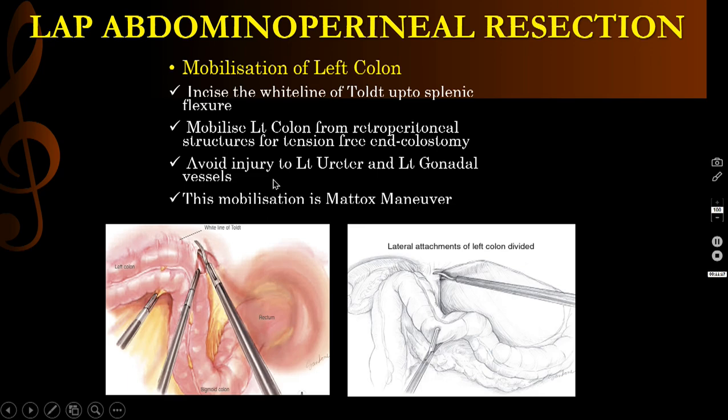And this mobilization is known as Mattox maneuver or medial visceral mobilization or medial rotation of the viscera.